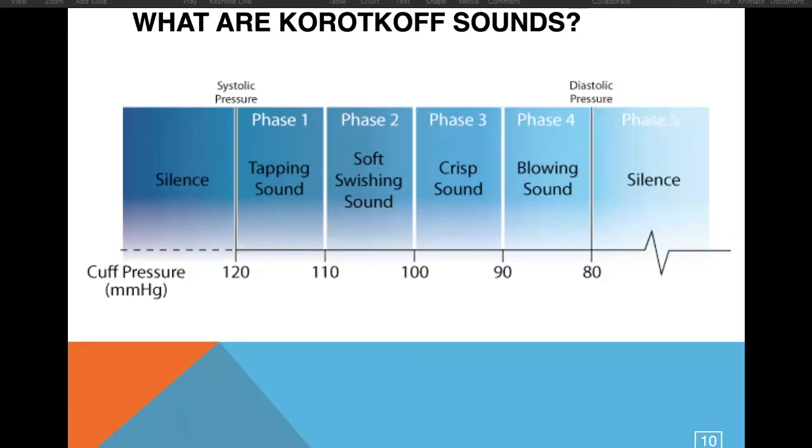I liken taking the blood pressure to releasing water from a dam. We're damming up the artery with that blood pressure cuff. So we're not going to hear anything initially because there's no blood flowing, there's no water flowing south of that dam. As we slowly release the dam and release water, initially there's that flood of water coming through, or blood coming through the artery. So it's going to be very distinct to begin with.